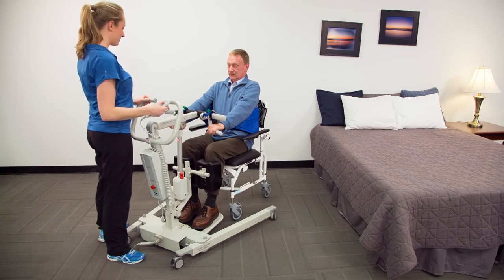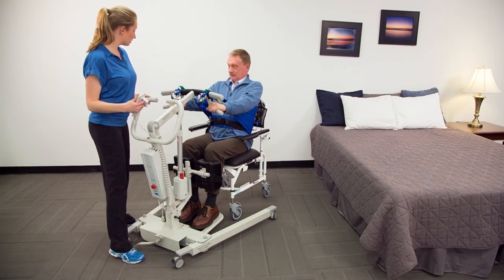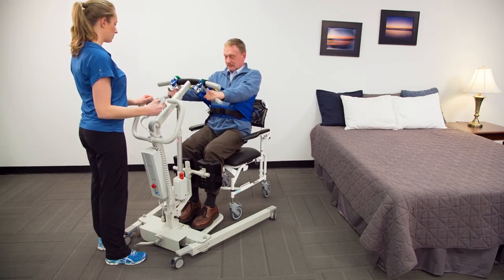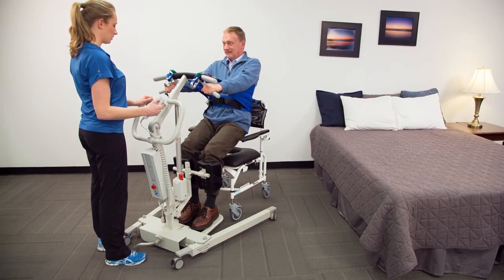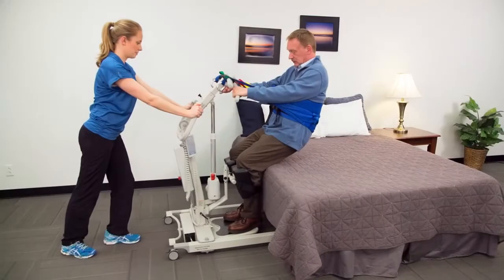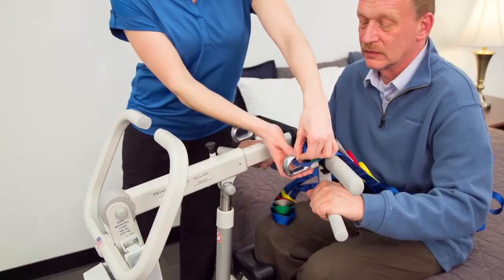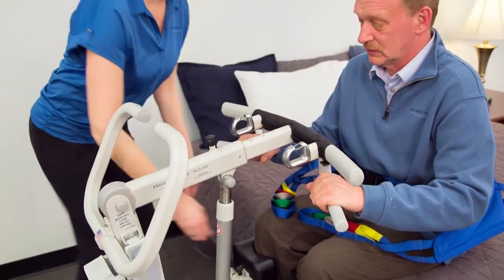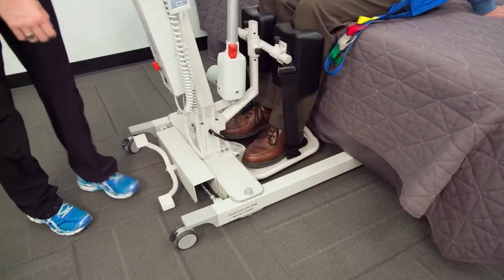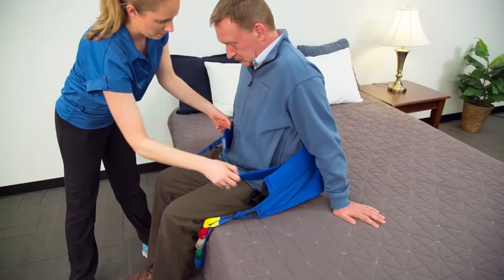Press the up button to begin to raise the patient off their seat. Pause and check to see that the sling is well positioned and feels safe and comfortable. If not, lower the patient, make the adjustments needed, and then raise them to the desired position. Hang the hand control on the carry hook. Unlock the wheels and transfer the patient to the desired seated location. Lock the wheels and lower. Unhook the sling loops from the connection hooks. Unfasten the safety straps from around the patient's legs. Unlock the wheels and move the lift out of the way and into a safe area. Remove the sling from the patient.